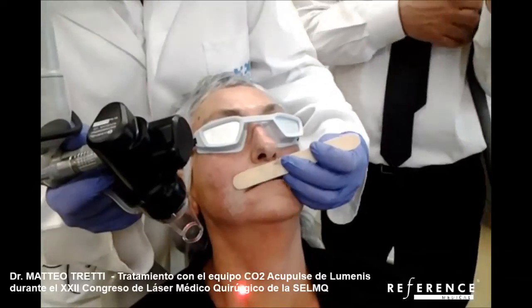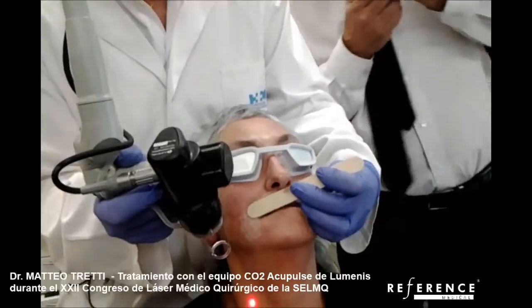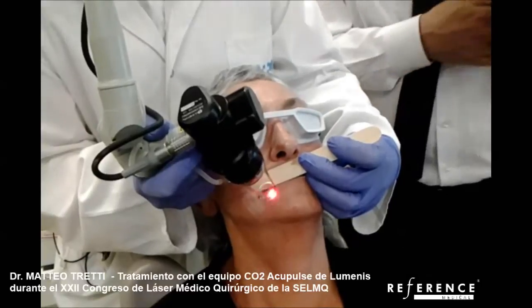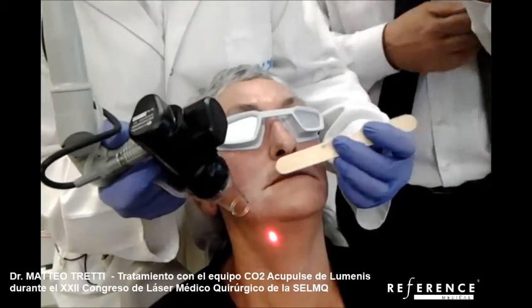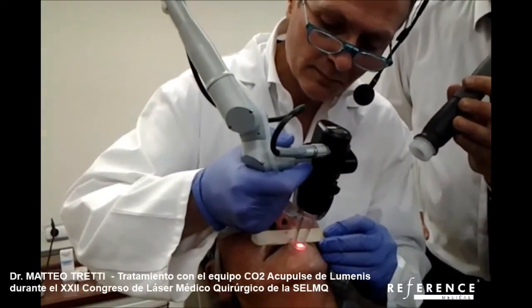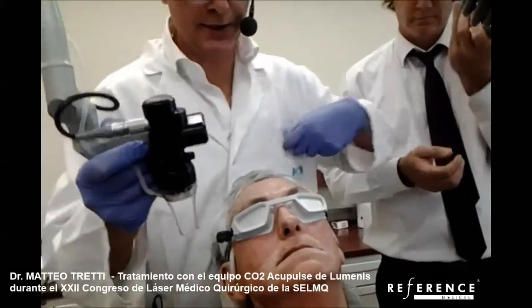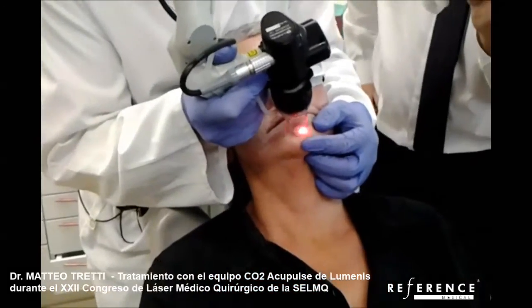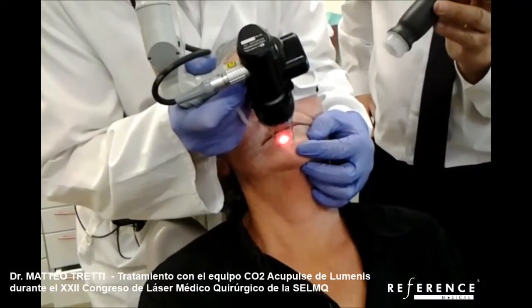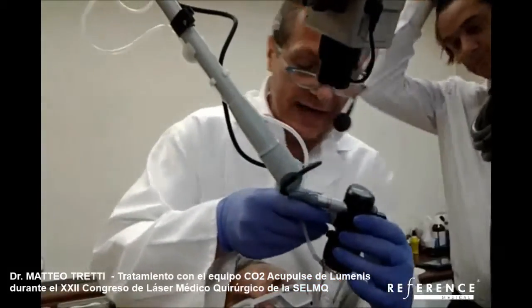You can apply the tongue depressor exactly where there is the line between the mucosa and the skin, so when you do the treatment there is no risk for the mucosa. Now it is easier to do the chin. The delay time between one shot and the other is 0.5 seconds.